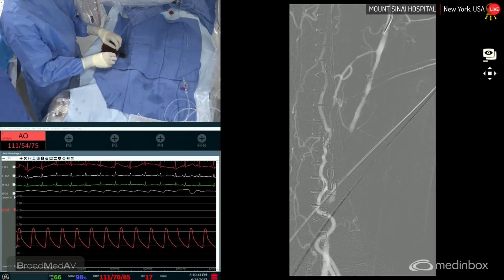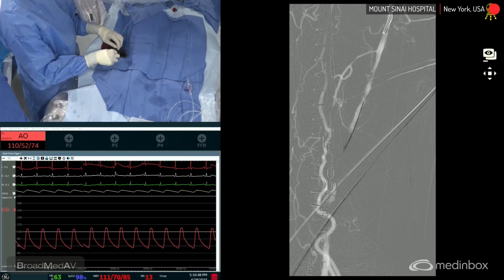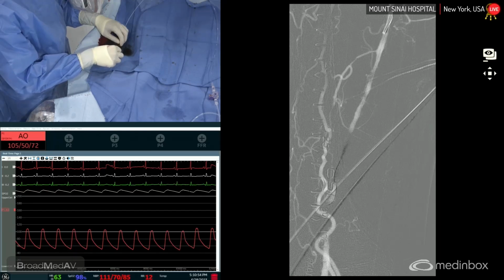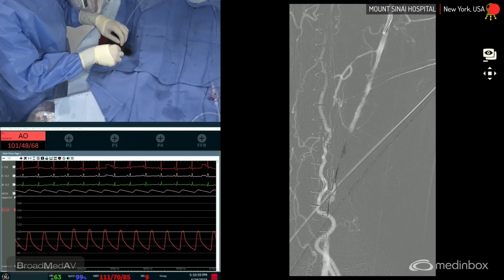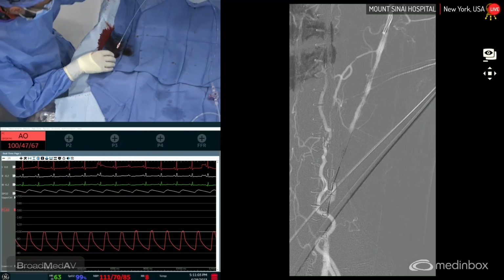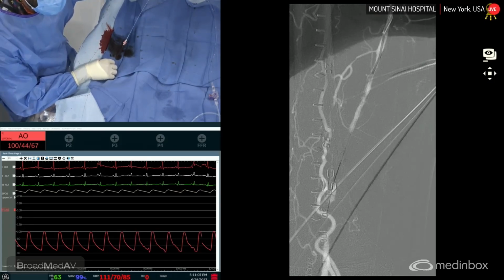So you can see Dr. Ali's chosen what we call an 014 wire, called a Command wire, to probe. And you can see that the Command wire looks like it's not even occluded, probably a very tight stenosis, and has crossed miraculously, which we knew it would. That's the lesion. Okay, another lesion distally. And again, you can see here, he's going to have to track the catheter down. We've got a support catheter. Unlike the coronaries here, we use 035 systems because we want to save money.